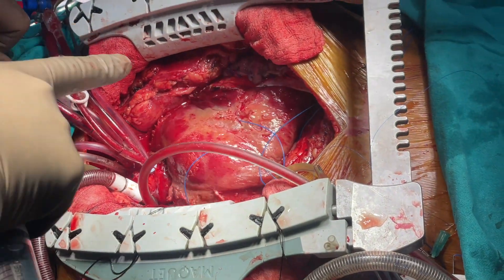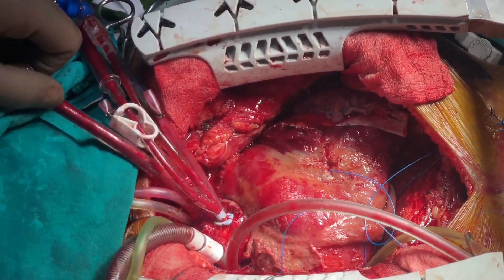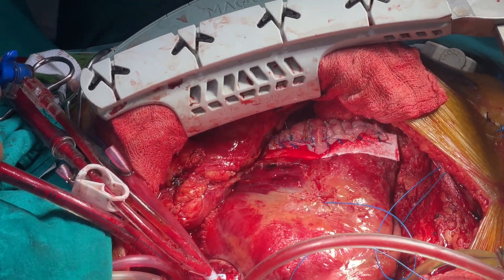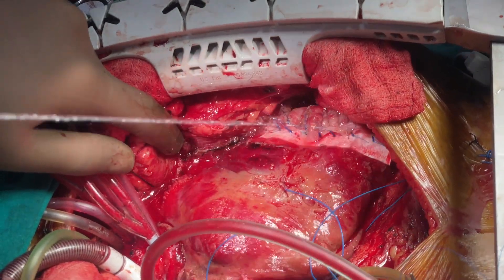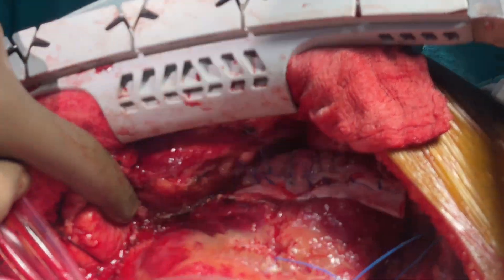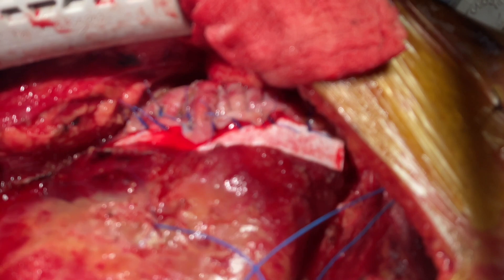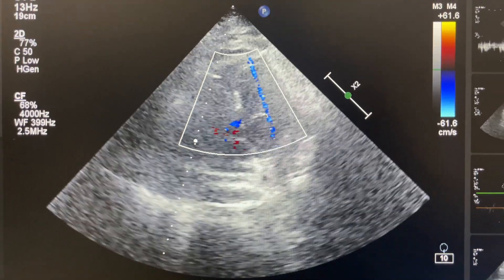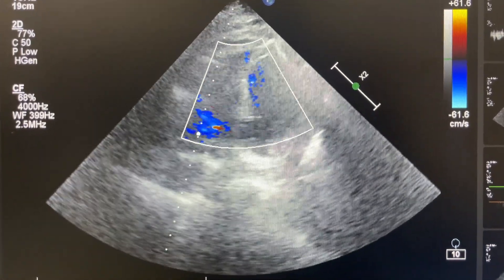Here you can see blood coming from beneath the pericardial strip — this eventually stops after protamine and packing. However, the bleeding that is a major concern is the one that comes from beneath the felt. This signifies that the interrupted sutures are gradually cutting through. In such a case, further repair should be done on cardiopulmonary bypass with cardioplegic arrest and no attempt should be made to handle this off-pump. This is the post-op echo of the patient showing the VSD patch in situ with no residual shunt.